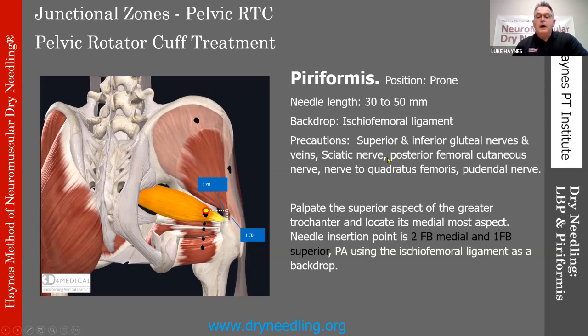And again, 1 up, 2 across, and then we'll needle down through piriformis to land onto the ischiofemoral ligament.